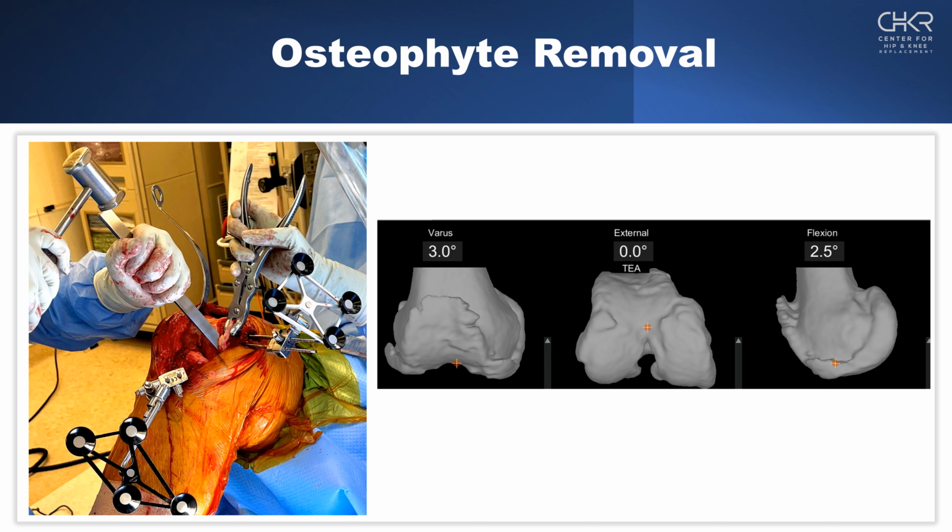So once the knee is open, the femur and the tibia are exposed, we start taking down the osteophytes to decompress the tenting on the capsular ligaments. And after that, we'll start with our baseline. So even before we get a baseline range of motion, we will start decompressing the knee, and it's very helpful to know ahead of time exactly where the osteophytes are so we can go after them specifically and deliberately.